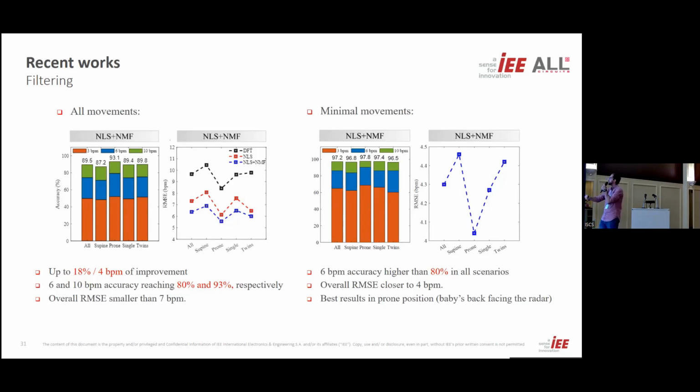Just to be able to compare to other works, during minimal movements, of course, the performance was much better, and we got more than 80% in all scenarios. Interestingly, we got the best results in prone position, so when the back of the babies was facing the radar.